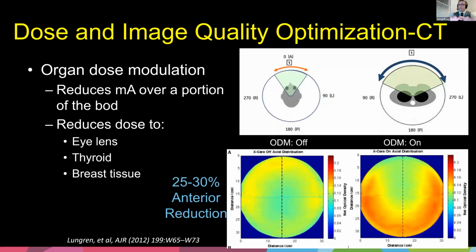The system will set up what's called a dose notification window. It'll say, hey, by the way, this scan you're about to do is going to be higher than normal. Do you want to go forward? And you would say yes or no. If you realize you did something wrong, you can back up and fix it, for example if I accidentally put 120 KV and it was supposed to be 100. So that happens prospectively.